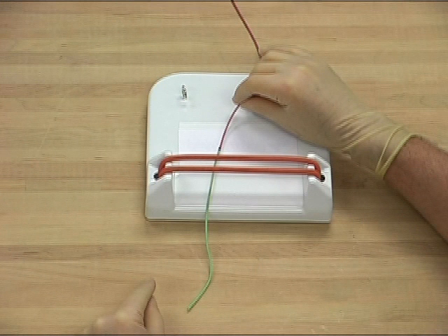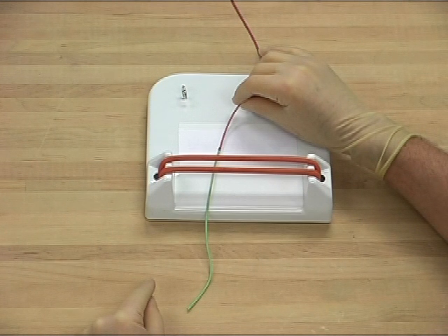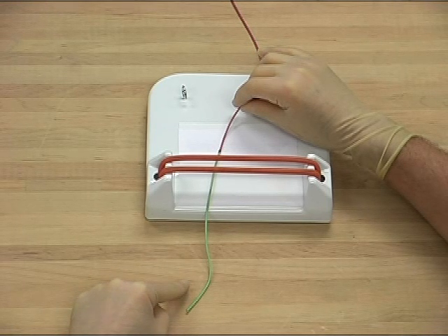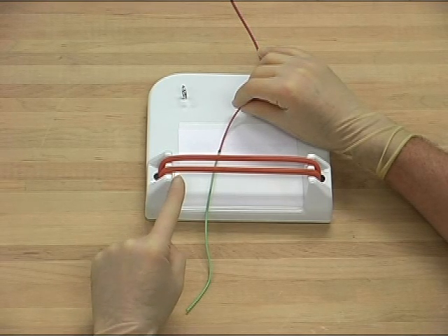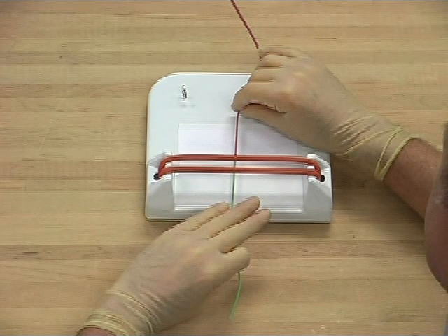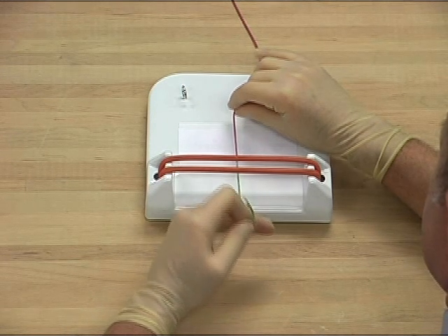This knot will be repeated, with the free end of the ligature or the suture pointing towards the surgeon and the needle end away from the surgeon. The pick-up is again important, using the index finger and thumb, with the hand fully pronated and the wrist supinated.